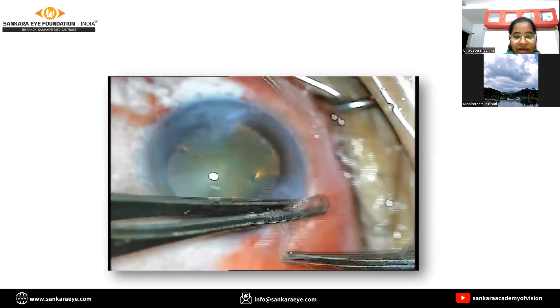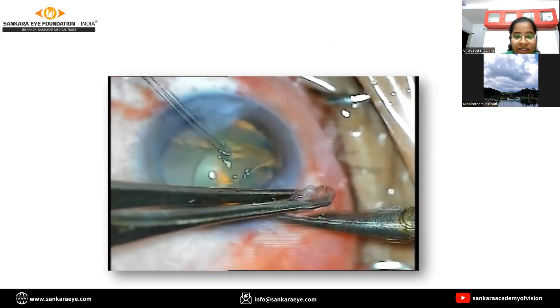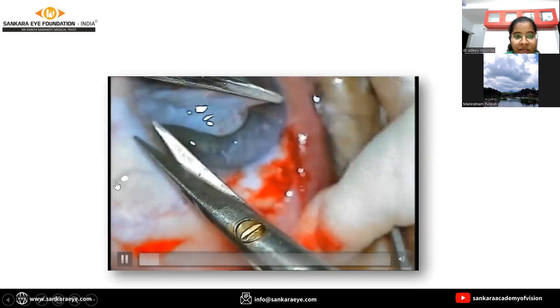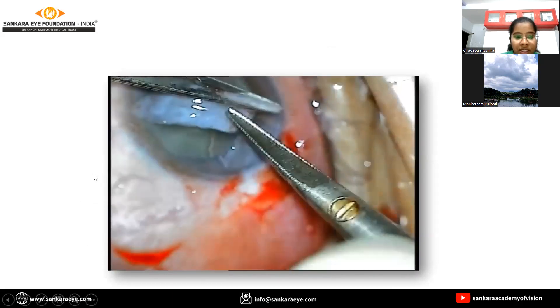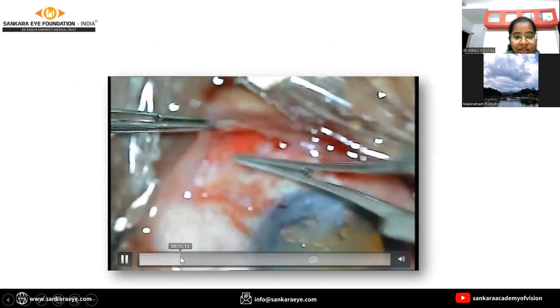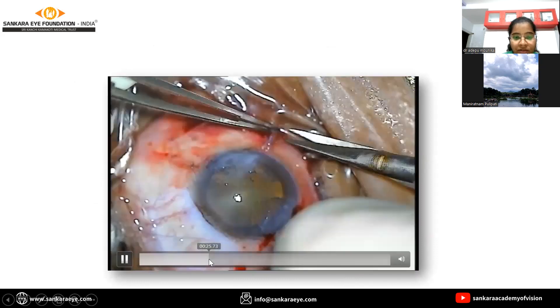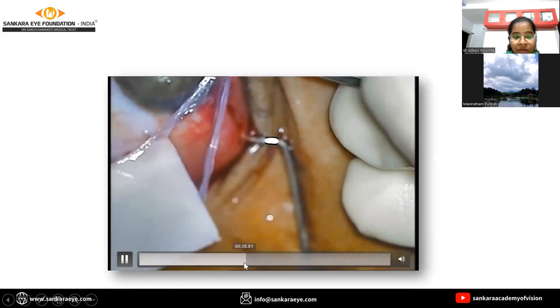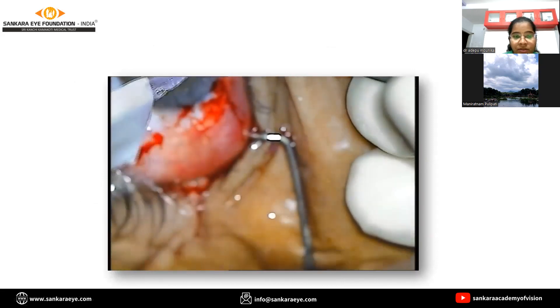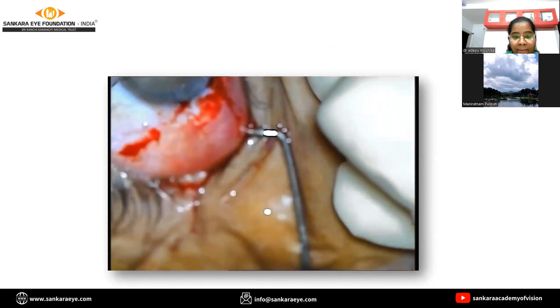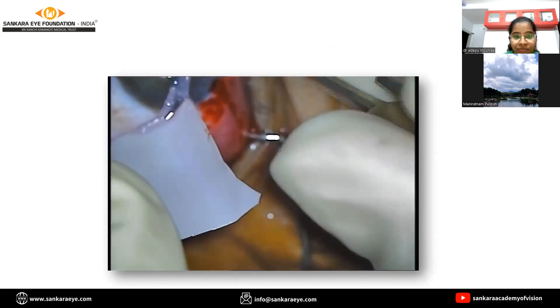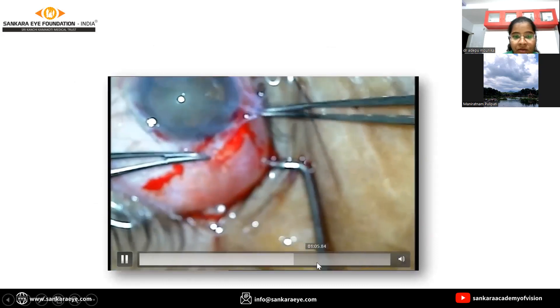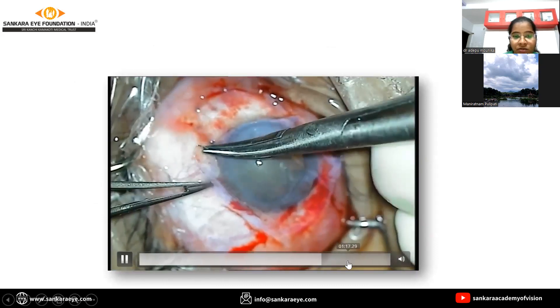Here is a small video showing a bi-headed pterygium. After excision of the pterygium, the conjunctival autograft is placed. Then amniotic membrane graft is placed with epithelial side up and finally sutured.